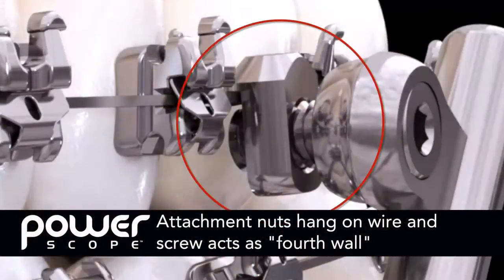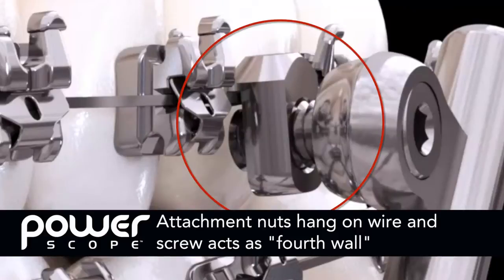Also, please note that the attachment nuts do not pinch the wire when properly installed. The nuts hang on the wire and the screw acts as a fourth wall to capture the wire when the appliance is tightened.